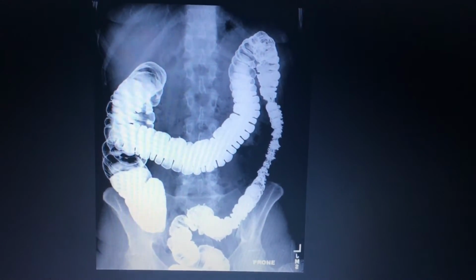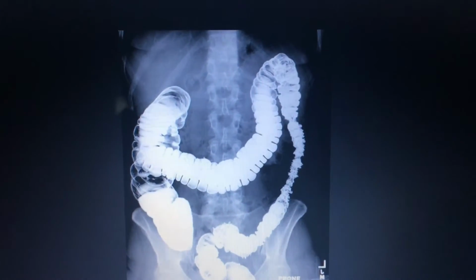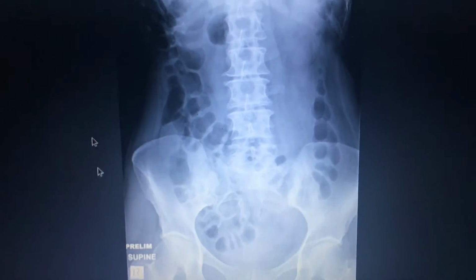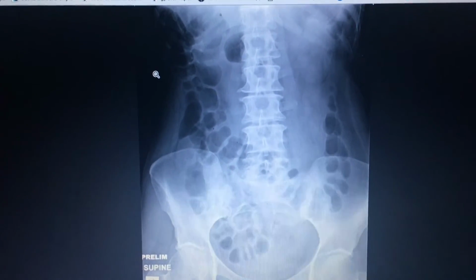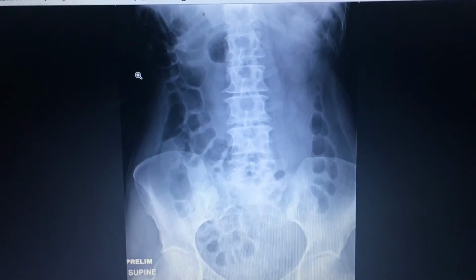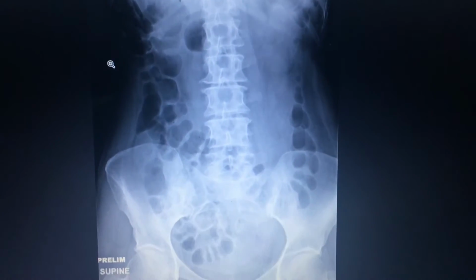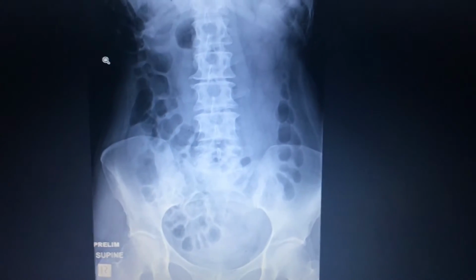Alright, now on to evaluate the images that I've taken. To start off with, we are going to go back to the scout. As you can see here, the patient is supine, as you've seen in the video. I'd also like to make a correction. I said the central ray was 1.5 inches above the iliac crest. If you notice, I actually didn't center there. You actually center at the iliac crest and mid-sagittal. So I just wanted to point that out.